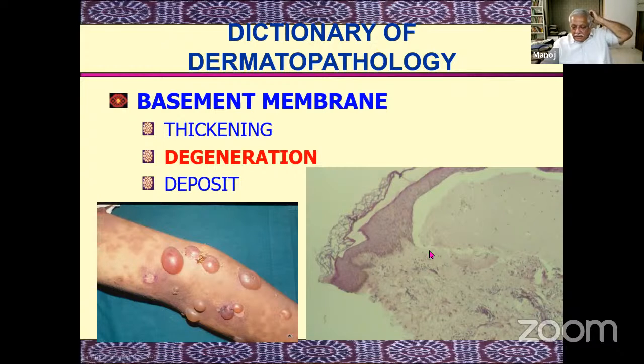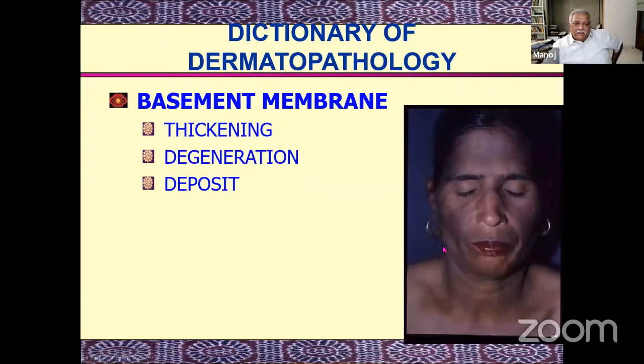Similarly, if the basement membrane itself is destroyed because of immunological reasons, you have a dermoepidermal cleft. But in this one, there are no epidermal cells present at the lower part. You can make out this. No epidermal cells. And the entire epidermis has gone up, and the dermoepidermal bulla is in between. This is an immunological destruction of the basement membrane material itself. This is also a bullous condition known as bullous pemphigoid.